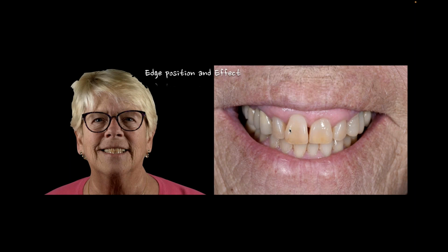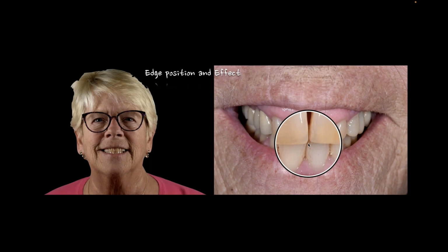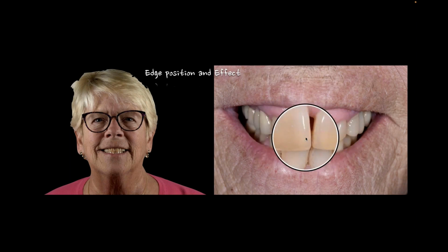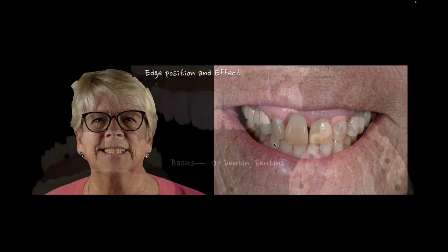So I do everything the exact same way. And by the way, just look at her enamel. Let me blow that up for you guys. Look at the enamel that you see there. Is this the kind of effect that you'd want to create for a certain case? Maybe. I get it. It looks a little ambery and there's that secondary dentin formation. At the same time, if I'm making a single central for this patient, I got to follow that. If I'm doing all the teeth, then I can improve on it, but I have to realize how much improvement, what that means for her and her final result.